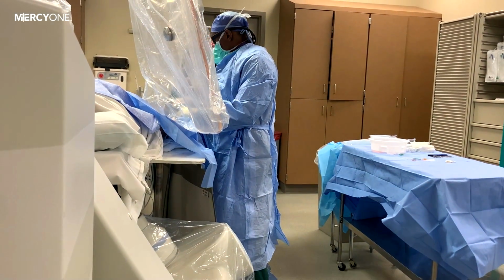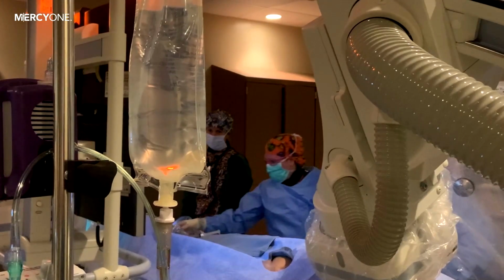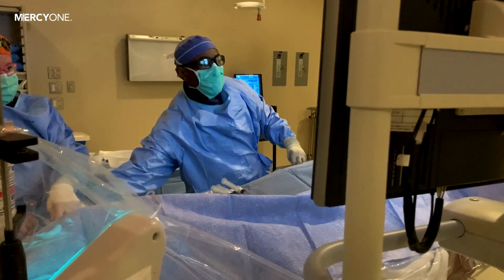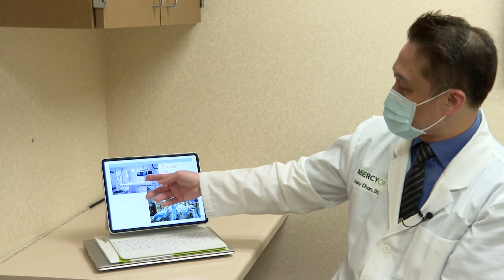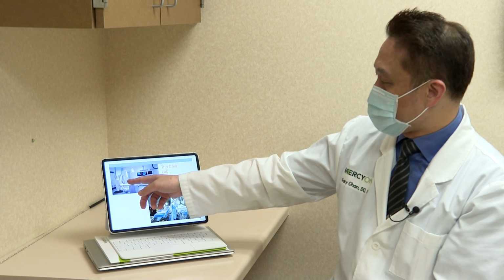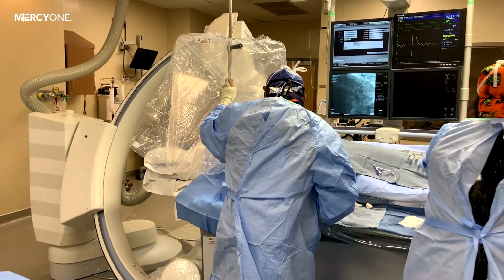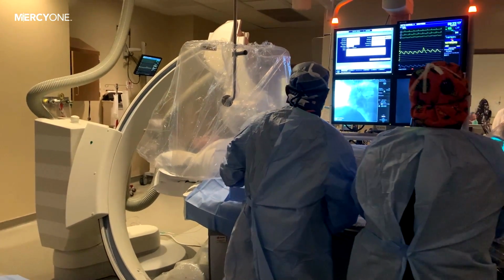A catheterization laboratory may look like a scary place with a big name, but it's a common stop for patients entering the hospital with possible cardiovascular problems. In the Cath Lab, the patient will be brought in such as this, with their heads up here near the imager and their feet down here. Cardiologists use diagnostic imaging equipment to visualize the arteries and chambers of the heart.